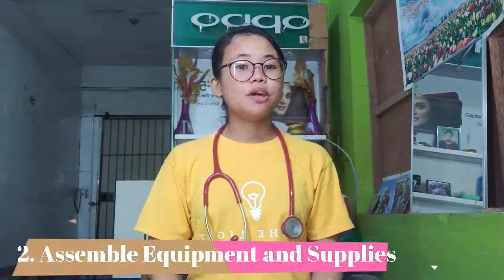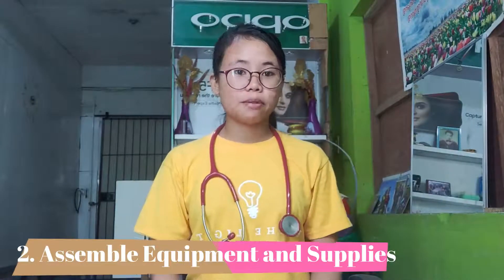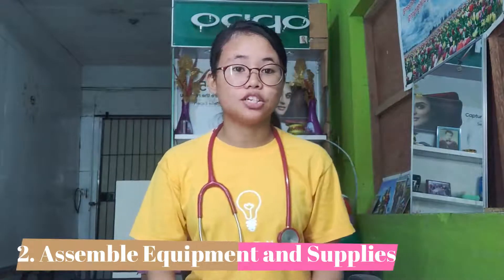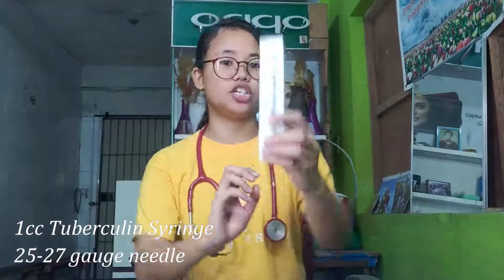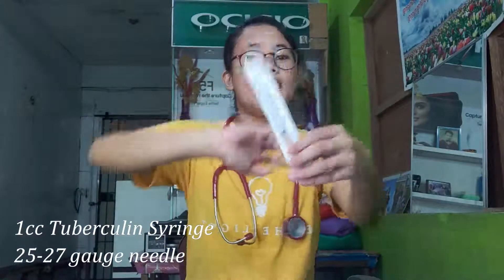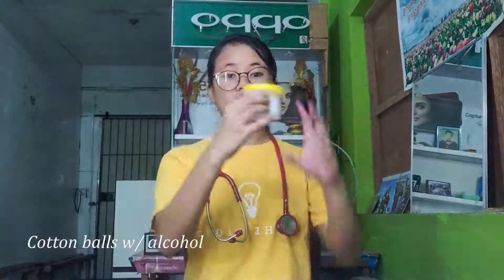Then, you will need to assemble the equipment and supplies needed for intradermal injection. First, you need a 1cc or 1ml tuberculin syringe with a 25 to 27 gauge needle. And then, you will need cotton balls with alcohol.